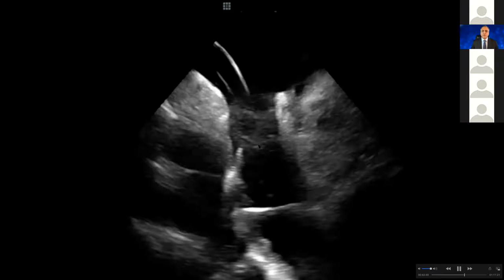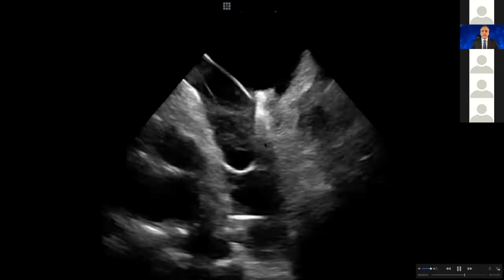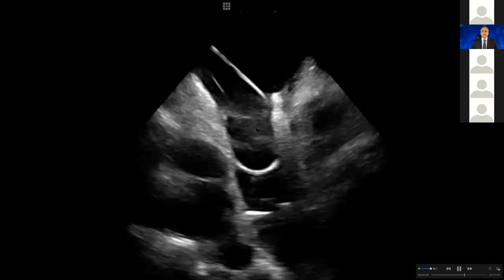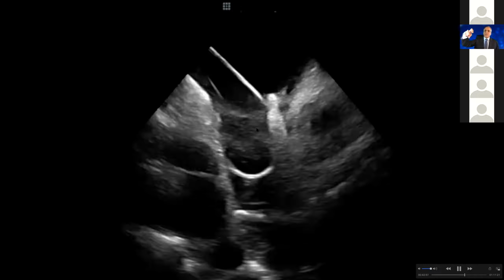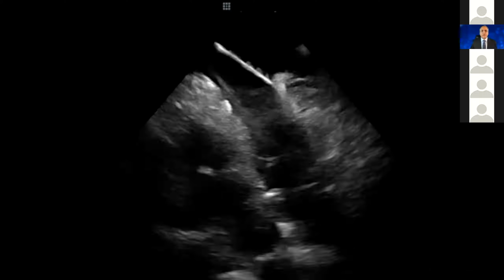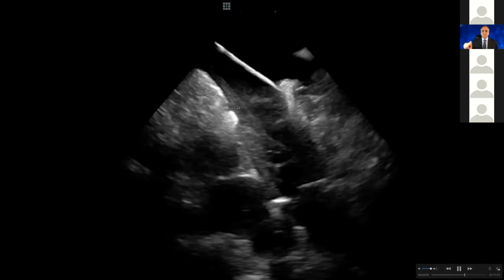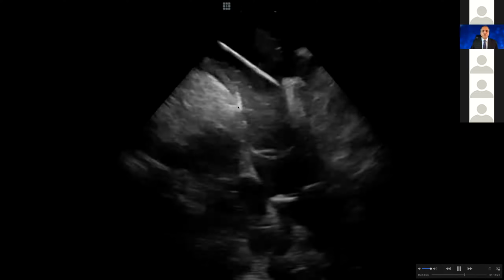And if I go into the SVC, usually you have to use the F curve, and you can do, again, a candy cane here. When you have this candy cane, you can just go down, rotate it 360 degrees, and perform this entire SVC with one circle of 360 degrees.